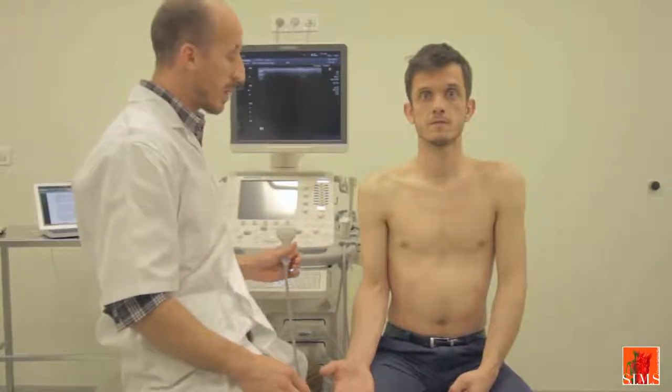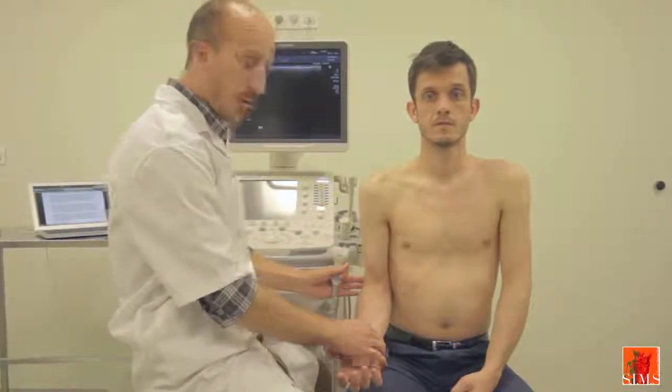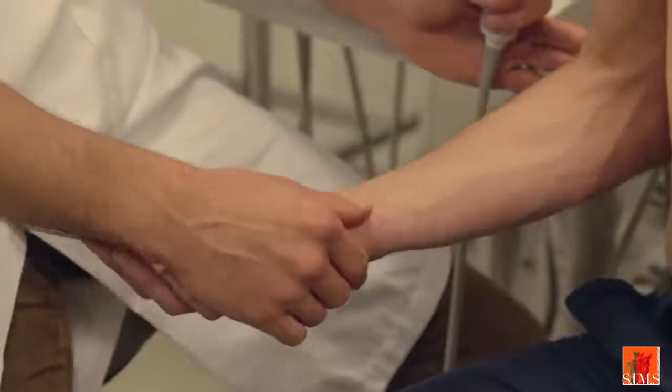Ideally, the ultrasound exploration of the subscapularis tendon is carried out with the arm and elbow held against the body, with a slight lateral rotation of the shoulder.